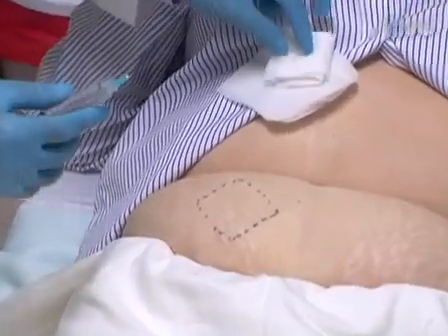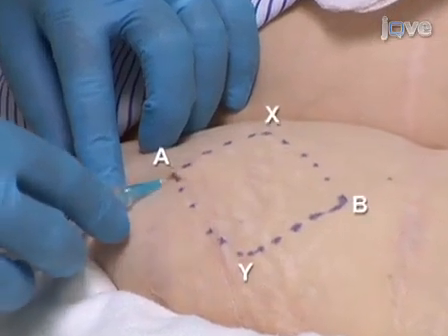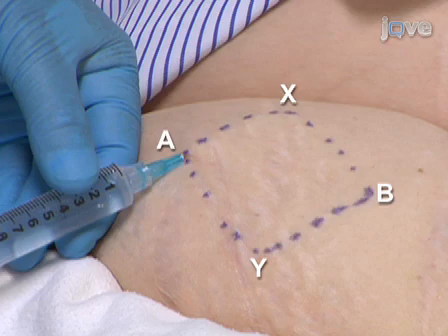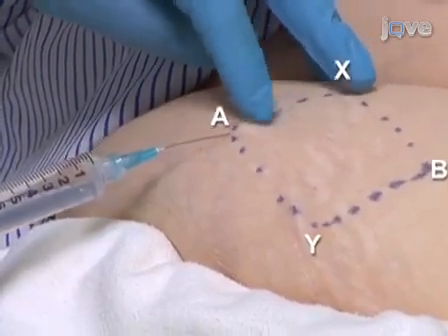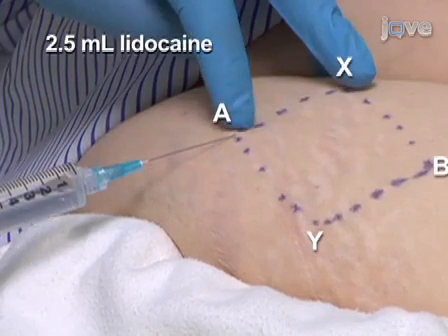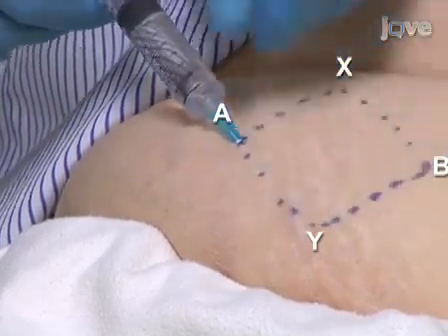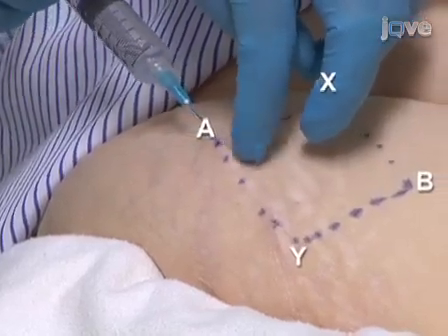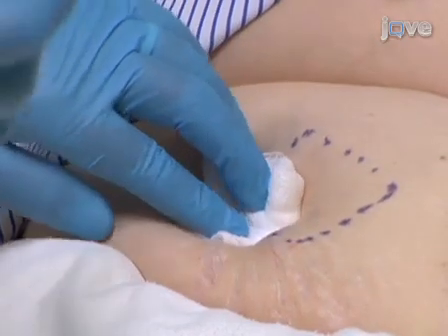Anesthetize along the borders of the rhomboid area. Start by inserting the 25 gauge needle just under the skin at point A, then carefully push the needle subcutaneously and tangentially parallel to the overlying skin surface towards point X. At point X, pull back on the syringe plunger to ensure the needle is not within a vessel. While withdrawing the needle back to point A, slowly push the plunger to infiltrate up to 2.5ml of lidocaine. Do not allow the needle to come out of the skin. Then change direction and push the needle subcutaneously to point Y. Confirm the needle is not in a vessel by pulling back on the syringe plunger, and dispense up to 2.5ml of lidocaine while slowly withdrawing the needle through point A. After withdrawing the needle, prevent bleeding by firmly applying sterile gauze.